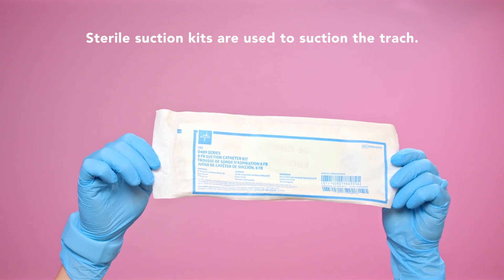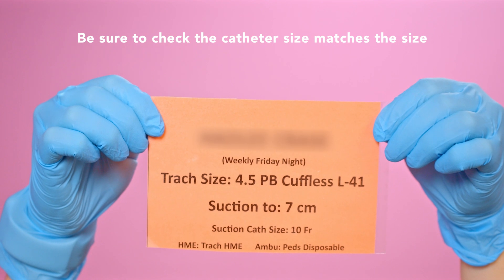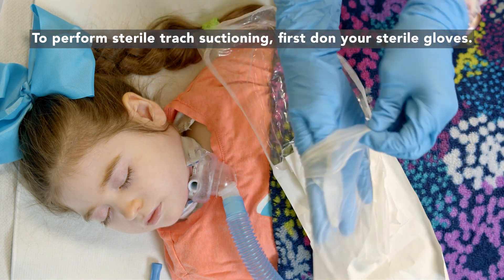Sterile suction kits are used to suction the trach. Be sure to check that the catheter size matches the size listed on your child's trach information card. To perform sterile trach suctioning, first don your sterile gloves.